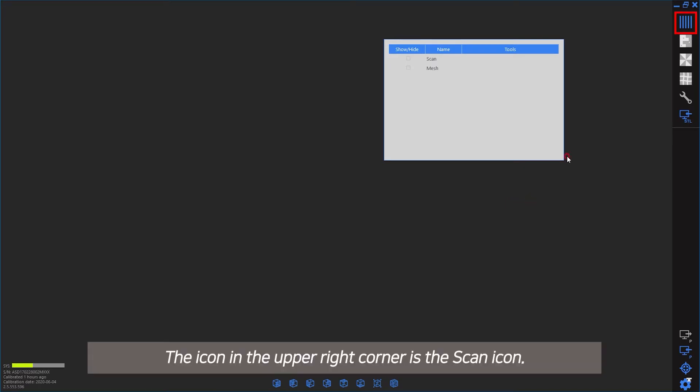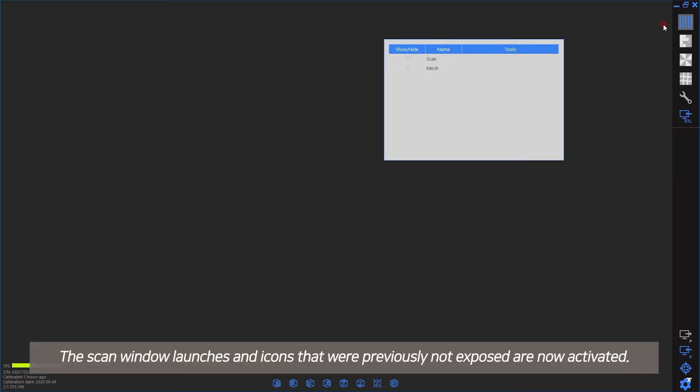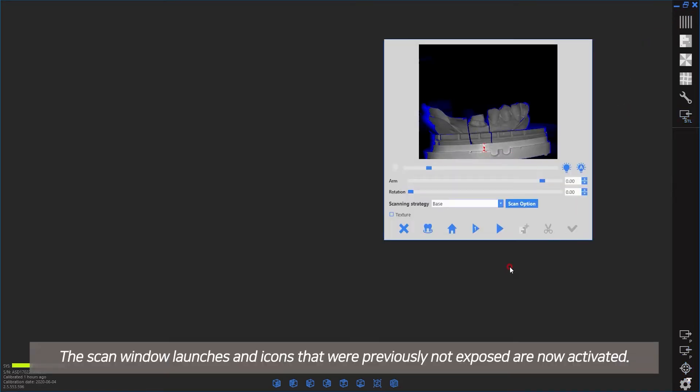The icon in the upper right corner is the scan icon. The scan window launches and icons that were previously not exposed are now activated.